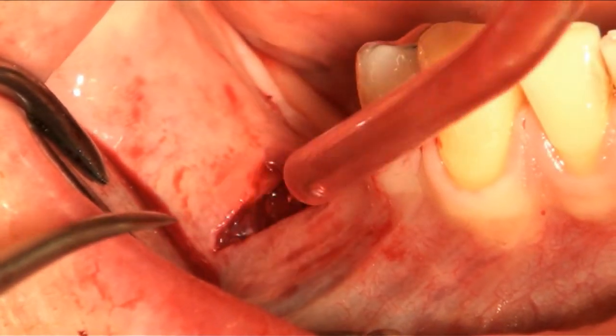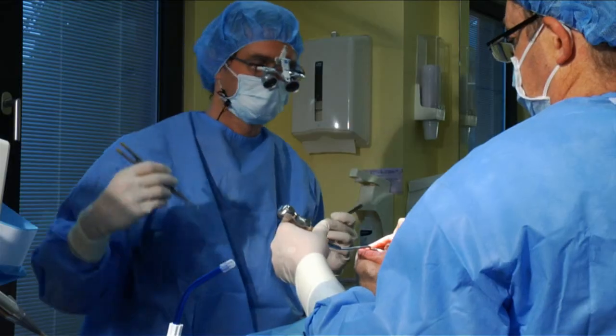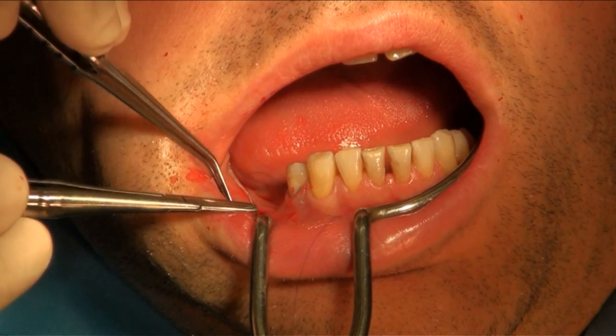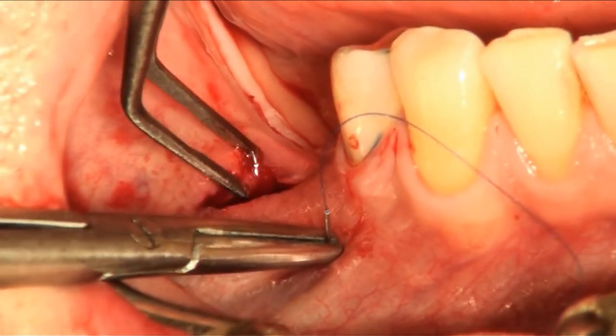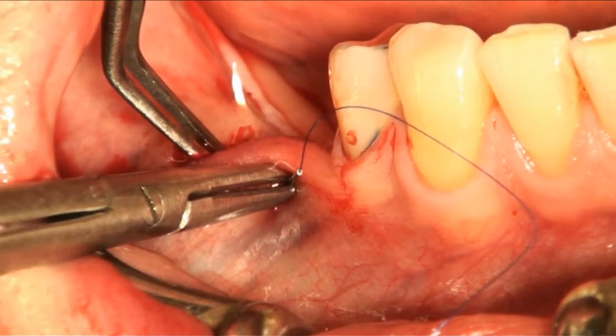And now we start a two-layered suturing. We start with a deep mattress suture for approximation of both flaps.